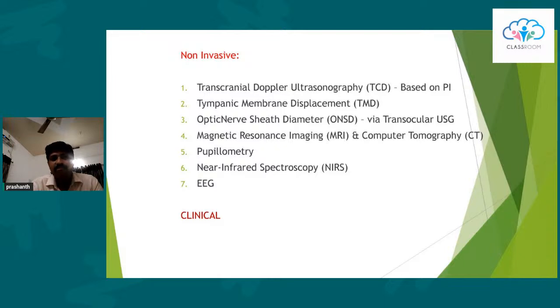Various other techniques have all been used and correlated with the actual ICP. However, the absolute values that are derived through these techniques are actually not very accurate, or they are primarily used as trend monitors and also to look at the response to your treatment.